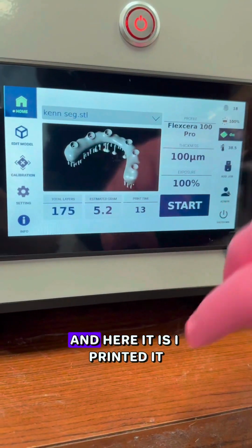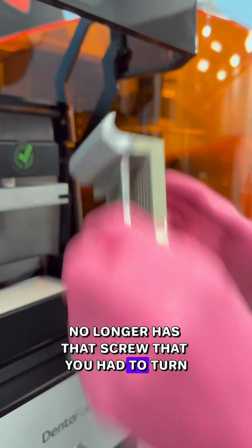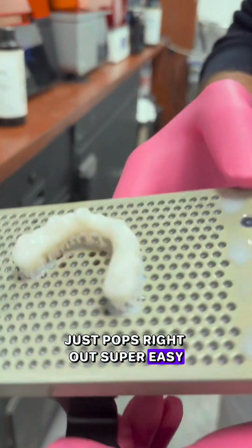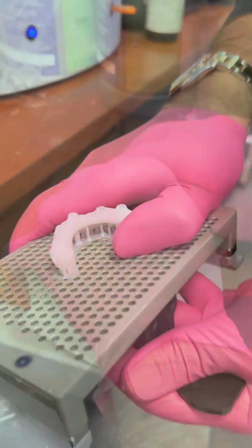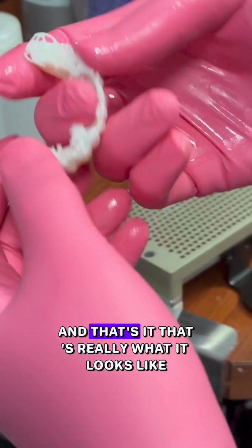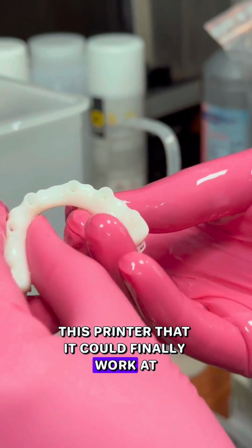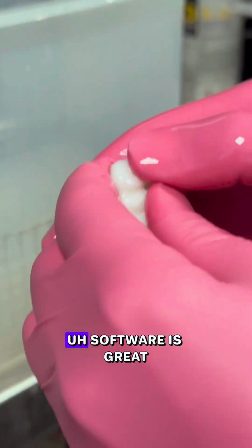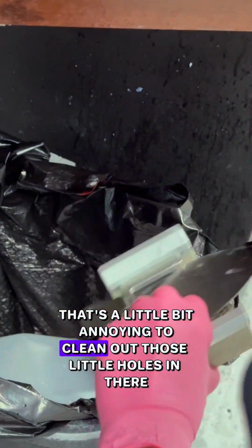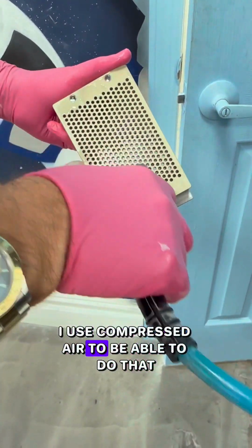And here it is. I printed it. It no longer has that screw that you had to turn. Just pops right out. Super easy. And that's it. That's really what it looks like. I'm really stoked about this printer, that it could finally work at 12-13 minute hybrids, assuming everything is preheated. Software is great. That's a little bit annoying to clean up those little holes in there, but I think they'll fix on that. I use compressed air to be able to do that.